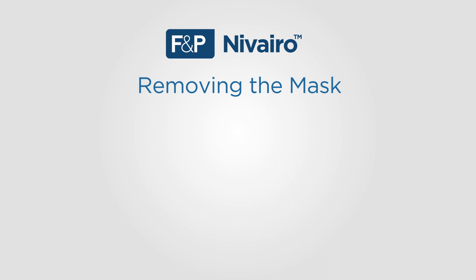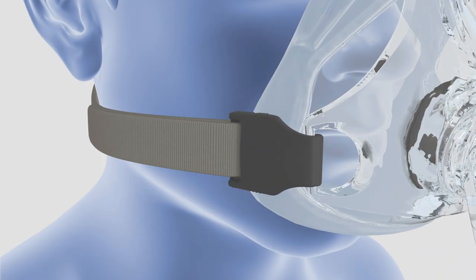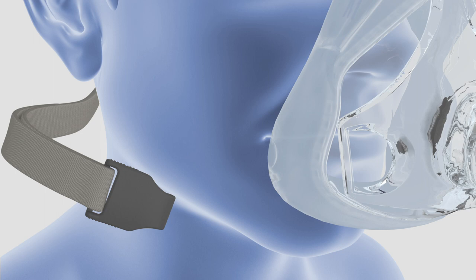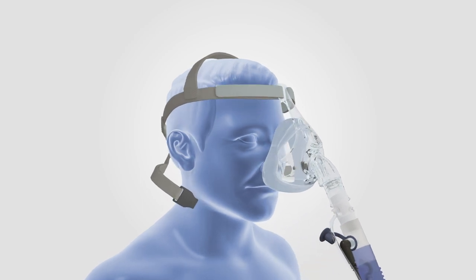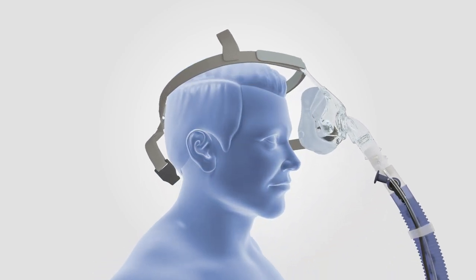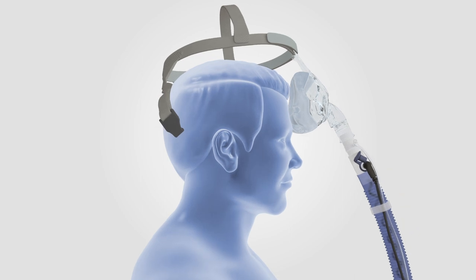Let us now look at how to remove Navarro full face masks. Always remove the mask by undoing the headgear clip on either side of the mask. By using the headgear clip, you should not need to undo the straps. Slide loose headgear off the patient's head and remove the mask. Keep the remaining three sides of the headgear attached to the mask.